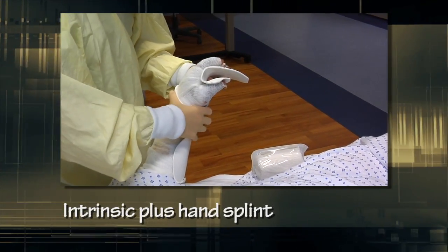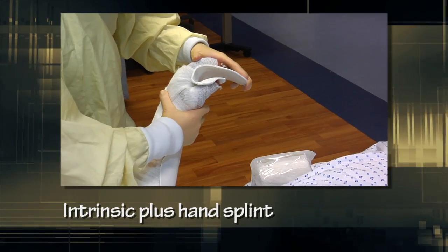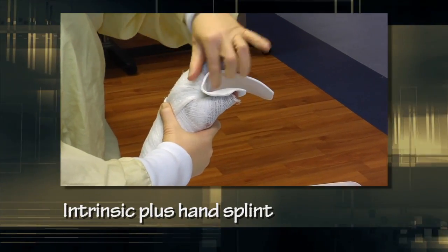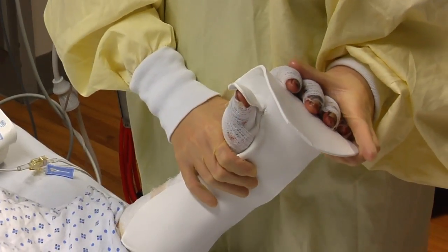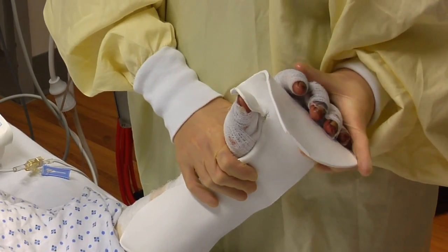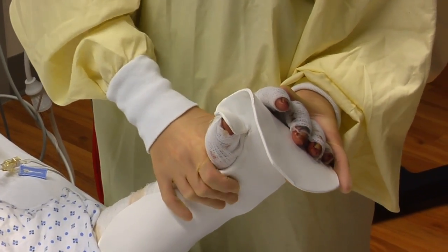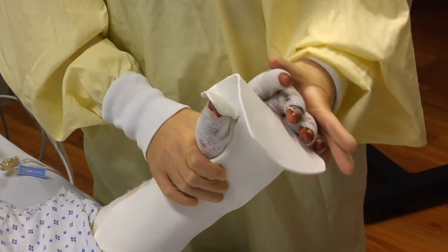The optimal position for the hand with dorsal burns is achieved with an intrinsic plus hand splint, with the wrist in extension, MCP joints in maximal flexion as tolerated, interphalangeal joints in full extension, and the thumb in abduction and opposition.